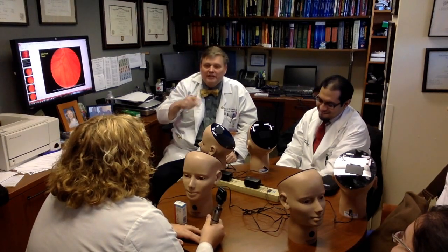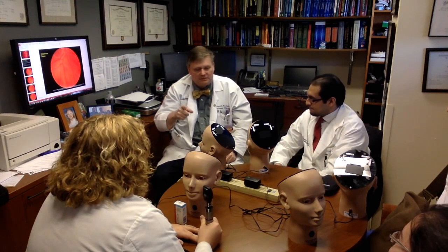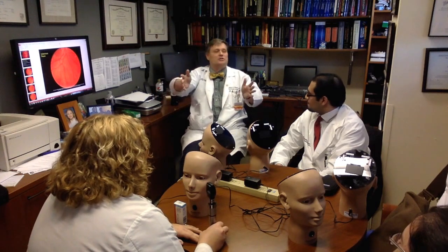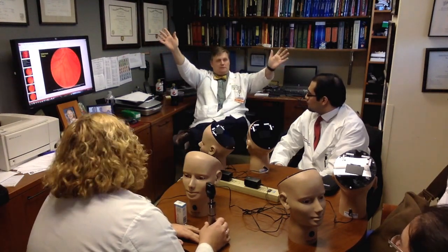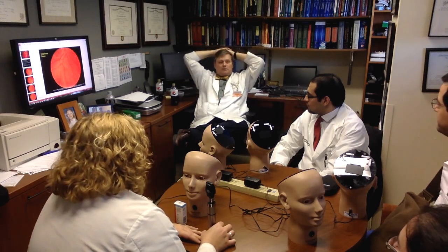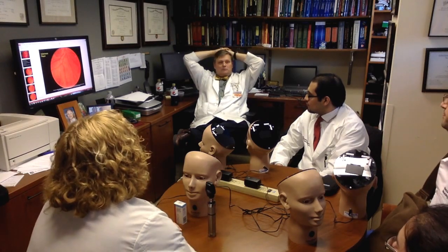Because then, when you get reasonably good at it, even when the pupils are small, you get a quick look, and you can say, okay, fine. At least the disc is sharp. There's not papilledema. The disc is sharp and it's not raised.